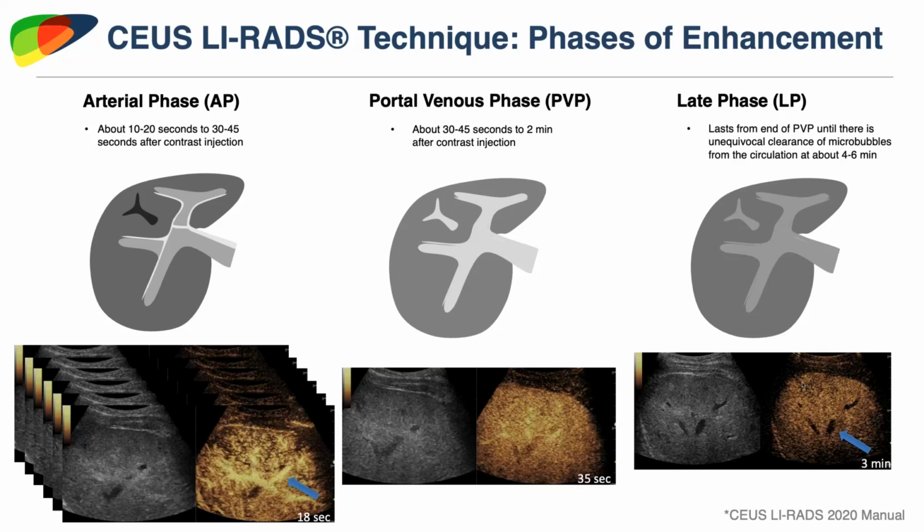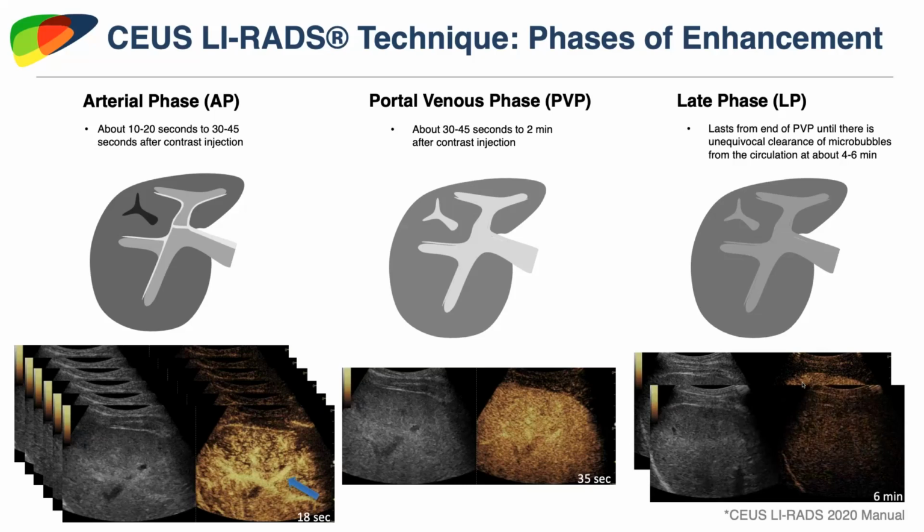So you do get, depending on how long those bubbles stick in the sinusoid, about 6 to 8 minutes of scan time in many patients, far after the kidneys and the blood pool wash out. So that's kind of a fun phenomenon. And then once the blood pool and the liver wash out here at 6 minutes, in this particular patient, we had just a couple of bubbles running around, but essentially this is time when you can consider re-injecting if you need to.